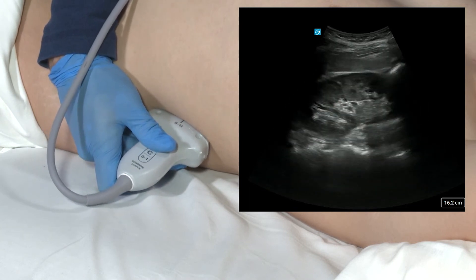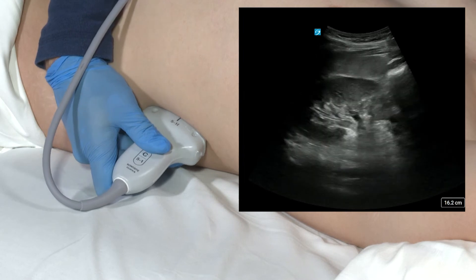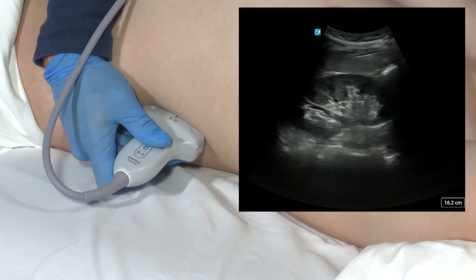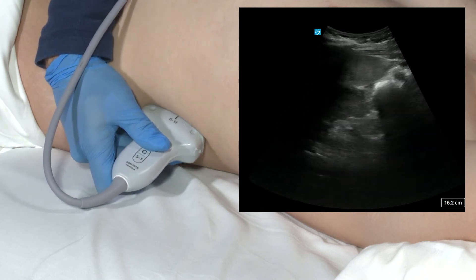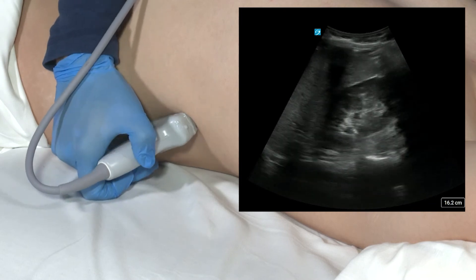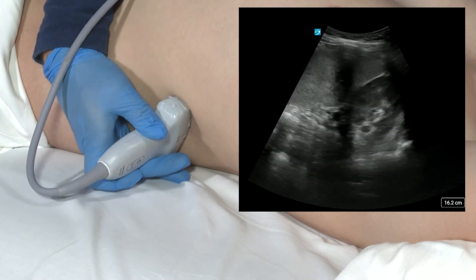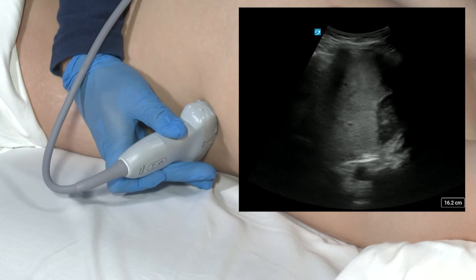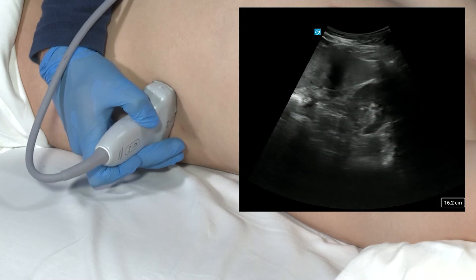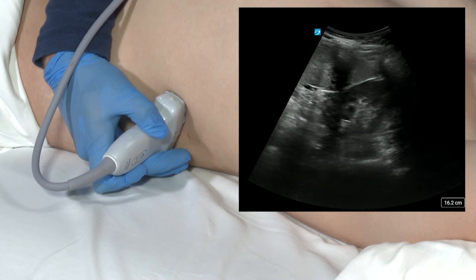A little gentle pressure will help spread the ribs to provide the best view possible. Once we have a nice long axis view, we'll rotate and fan the transducer so that we can see through the parenchyma into the sinus and again through the parenchyma. To obtain the short axis view, we're going to rotate the transducer 90 degrees counterclockwise and fan through the middle, up into the superior pole, then down through the mid and to the inferior pole. This is a complete two-view image and exam of the left kidney.